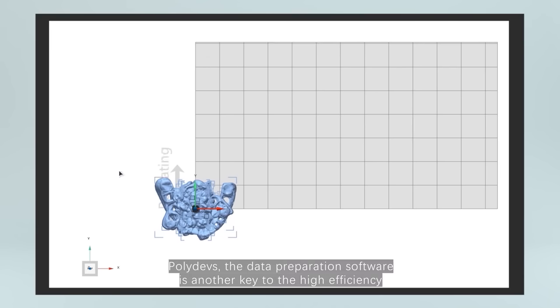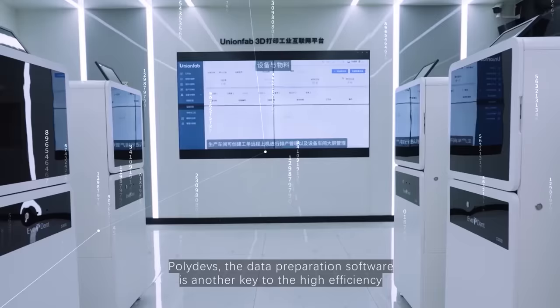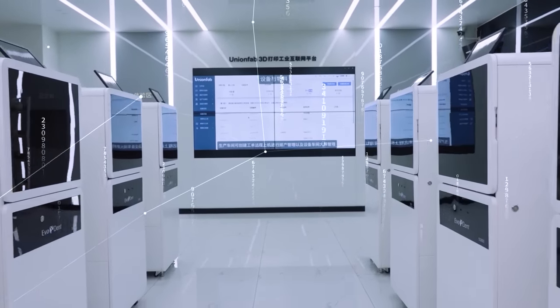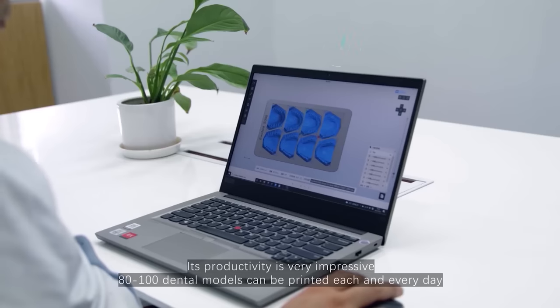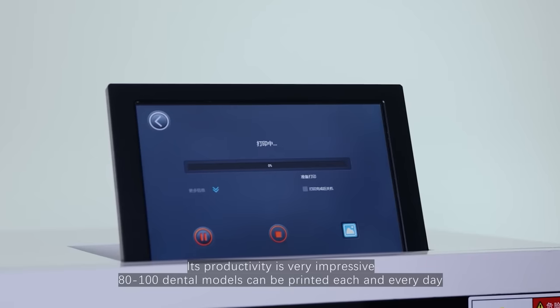Polydevs, the data preparation software, is another key to its high efficiency. Its productivity is very impressive — 80 to 100 dental models can be printed each and every day.